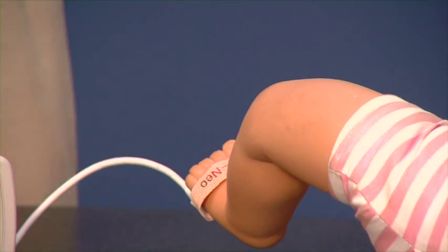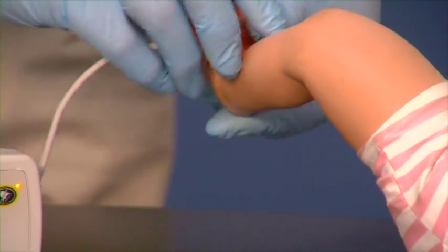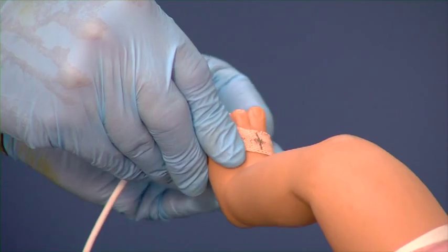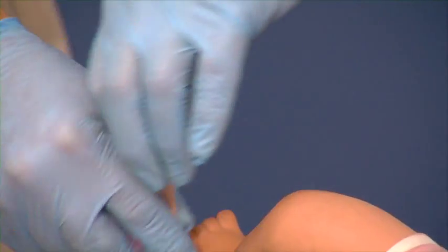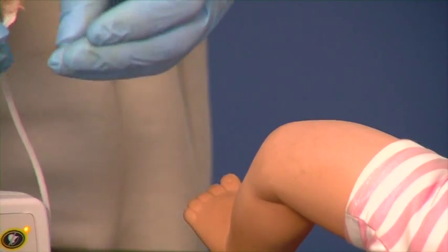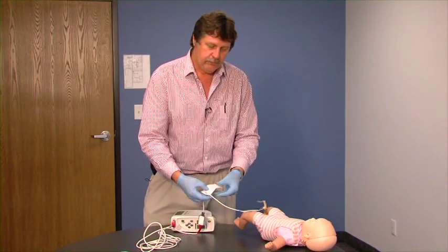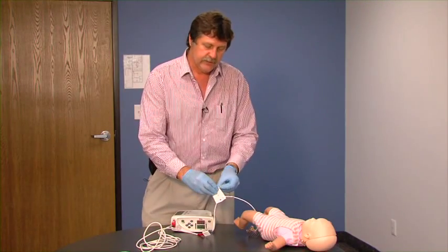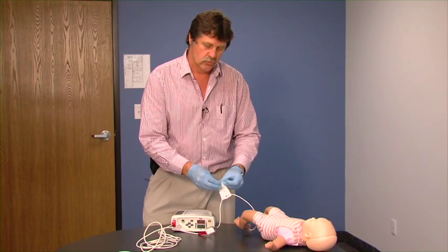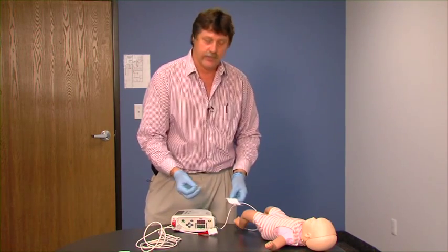Every four hours we're going to remove this. We can move it on the same foot, put it on the different foot, or put it up on the patient's wrist — we can move it around. If it loses its adhesiveness, we can peel off one of these little adhesive dots and use this to adhere it to the patient's foot.